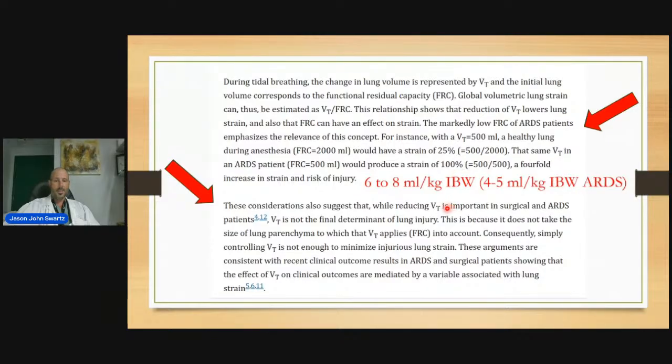So that's very important. These arguments are consistent with recent studies in clinical outcomes result in ARDS in surgical patients, showing that the effect of tidal volume on clinical outcomes are mediated by a variable associated with lung strain. So the considerations also suggest, while reducing tidal volume, it is important.